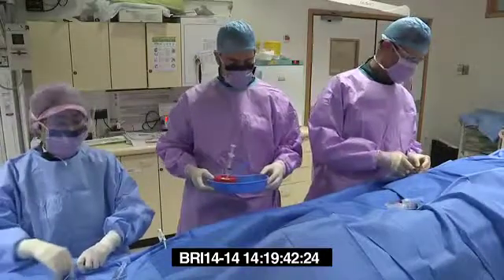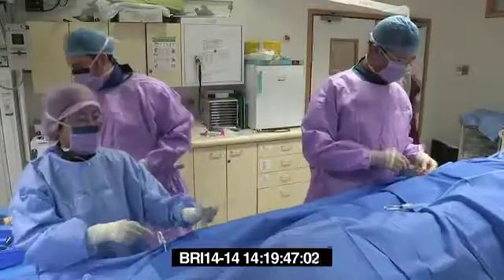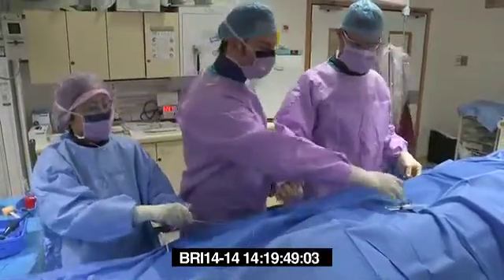Going to get a bit of heat and warmth up by your arms, so that's entirely normal. That should pass off after a second. That's just some of the medication we use. Fine.